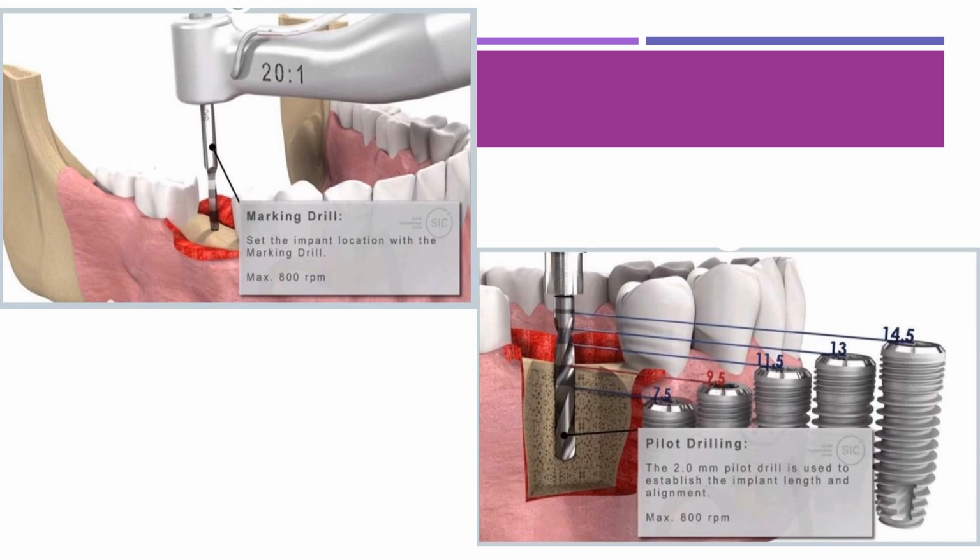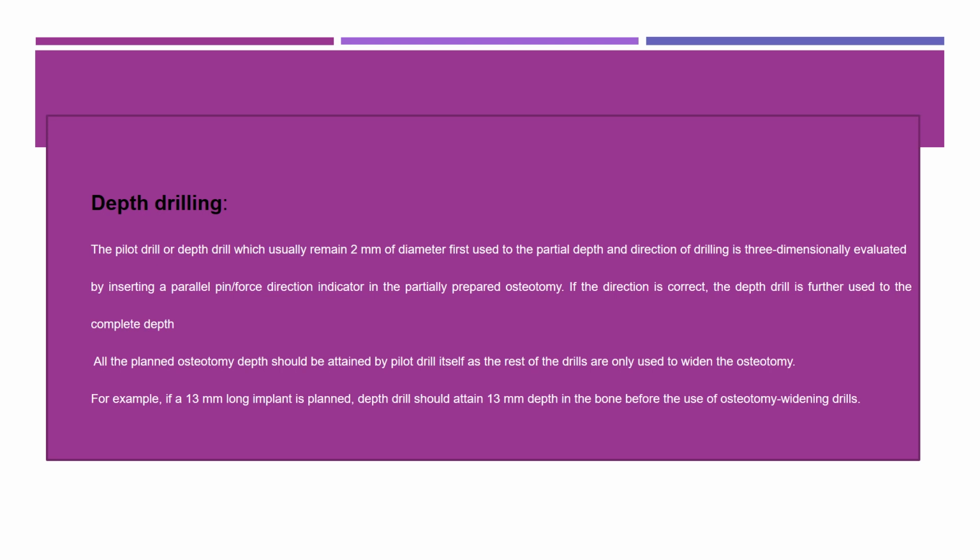Okay, there should always be a pumping motion, that is, an upwards and downwards motion, which is important to avoid overheating and necrosis. Okay, so coming to the depth drilling, there is a pilot drill or depth drill which usually remains 2 mm in diameter.